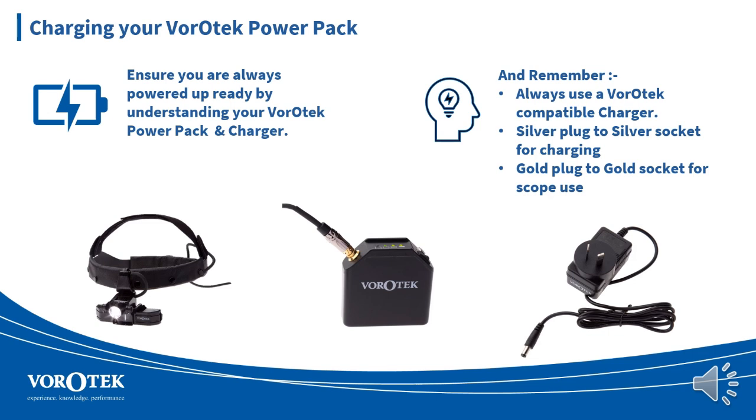To charge your power pack, please only use the VorOtek compatible charger provided, and plug the silver plug on the charging cable into the silver socket on your power pack. Once turned on at the wall, a red light will appear here to indicate that it is charging, and the 4 lights on the top of your power pack will turn red. When the charging cycle is complete, both the charger and the 4 indicator lights will change to green. The power pack does not need to be turned on to charge, and in fact we recommend not to.